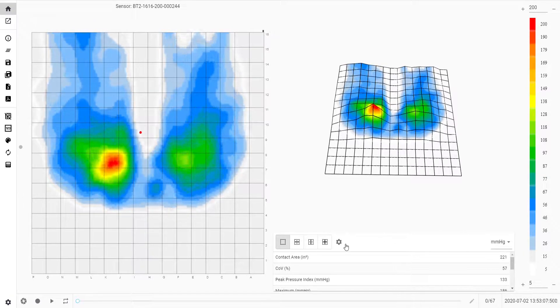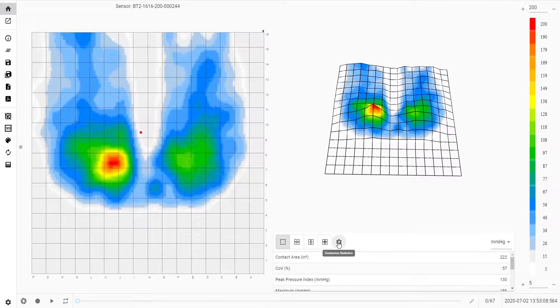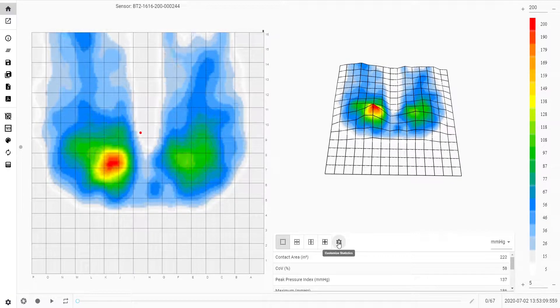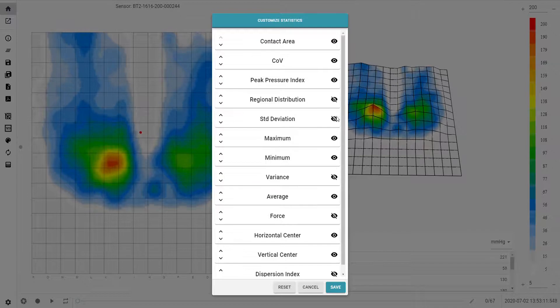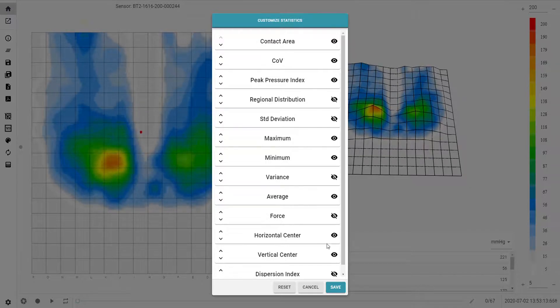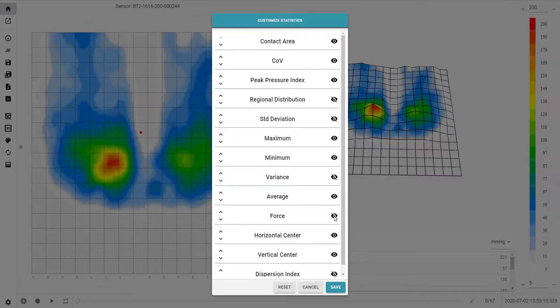On the bottom right of the screen is the statistics table. If you click on the customise statistics button, you can select which statistics you wish to measure.